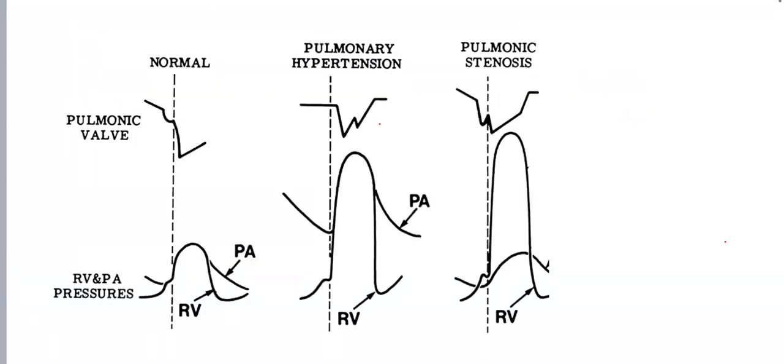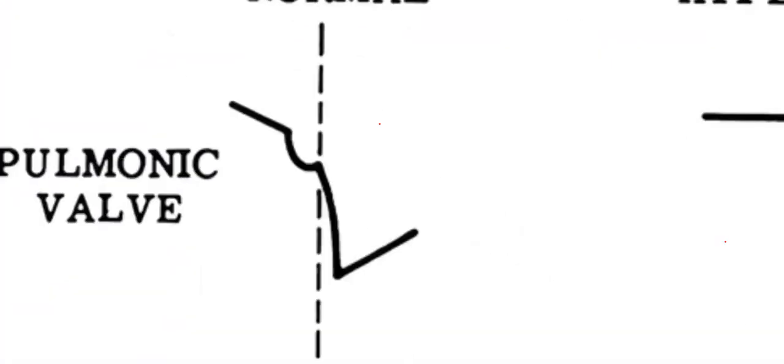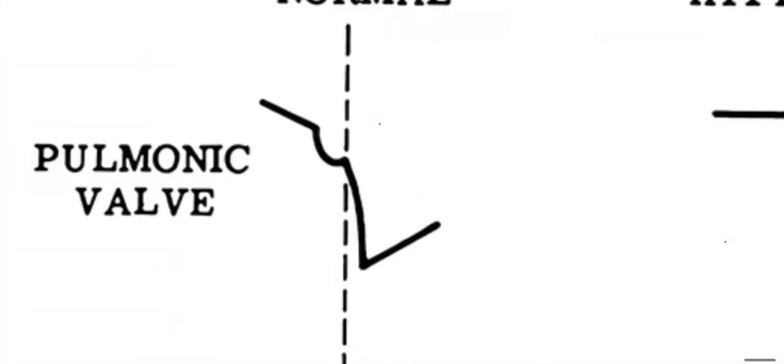First, the pulmonary valve M mode is usually derived from where? From the parasternal short axis, with the aorta in the middle and the pulmonary valve on the right. You put your interrogation line and you get M mode. Usually you get 1 leaflet at a time. You don't get 2 or 3 leaflets, though there are 3. You get 1 at a time. So it looks like that. This is the normal one.